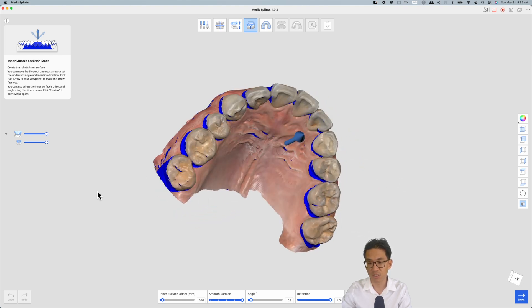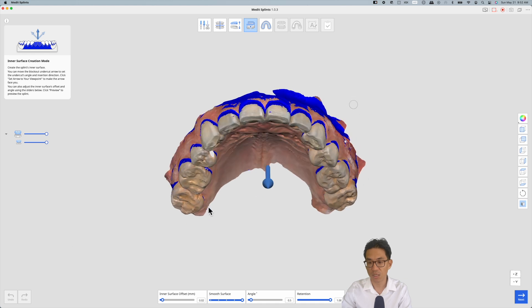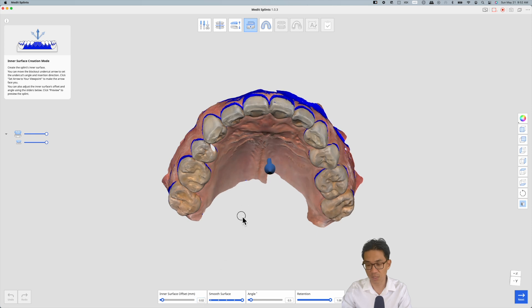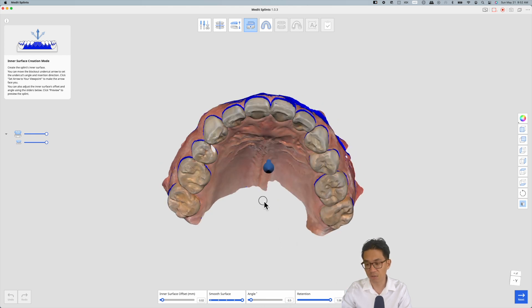This arrow here is just telling the passive insertion of the appliance which I'm happy with. Then we like to set the offset to 0.02mm just so that it's not too snug. Set the smooth surface to max, angle to 0.5, and retention all the way to 1.